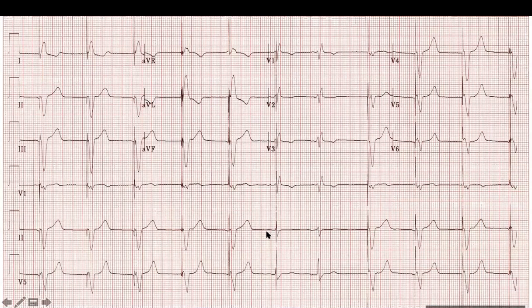Over here, you're not sure if it's sensing the atrium or not. If it's sensing the atrium and then paced, okay. Sensing the atrium and then sensing the ventricle, it's okay. You would imagine there should be atrial activity before the QRS if there is an atrial rhythm, because usually it either senses and inhibits, and if there is no signal, it should pace. So we don't have any evidence of atrial lead activity. So most likely it's a single chamber device.